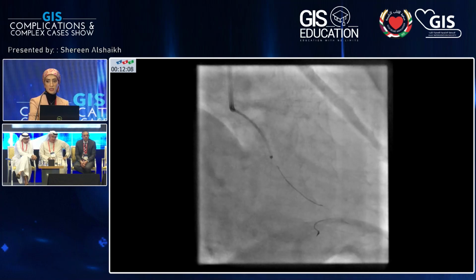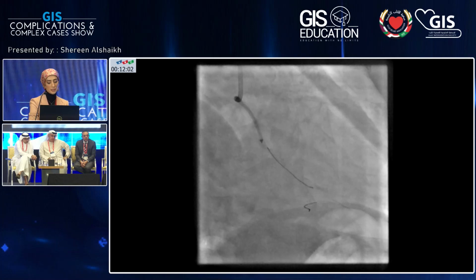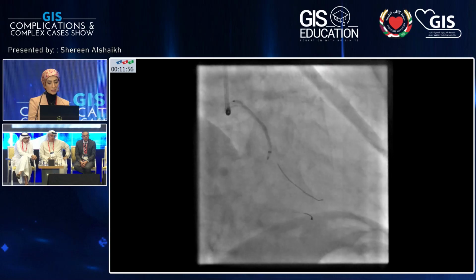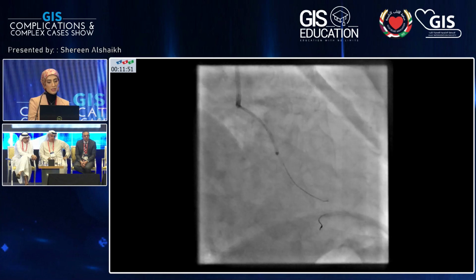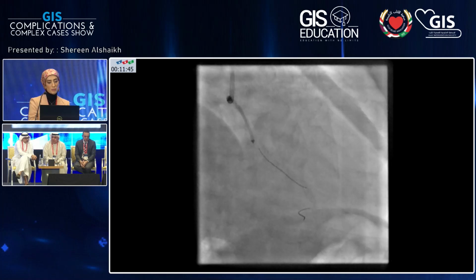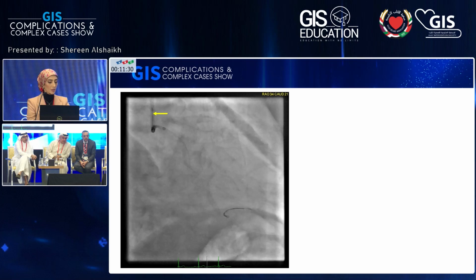Therefore, he planned to deliver the stent. He used a 2.5 by 48 stent to try to stent the third obtuse marginal into the mid-AV circumflex. As you see here, there was huge difficulty in advancing that stent, with the catheter and guide liner all coming back. So this failed. He pulled back the stent and decided to go ahead with further pre-dilatation. Suddenly that 2.5 NC balloon was also stuck in that catheter, and you can even see the OM wire was pulled back.